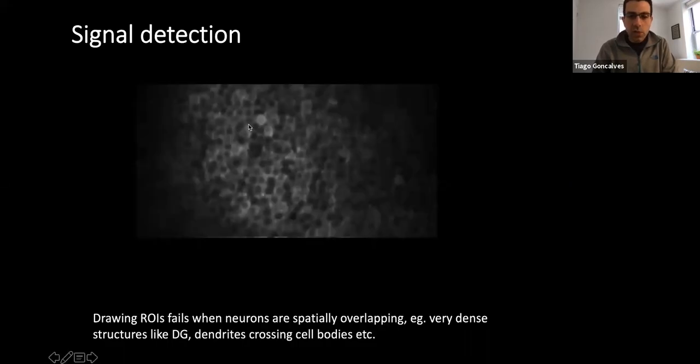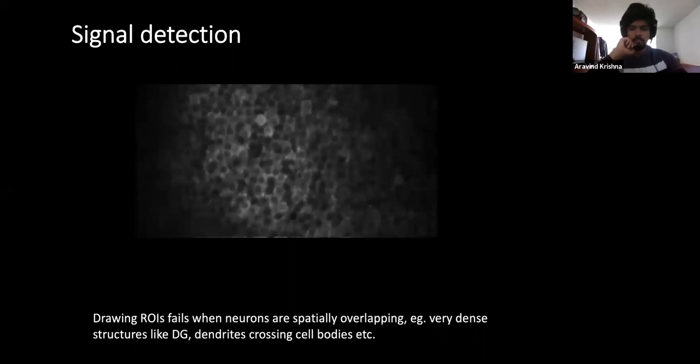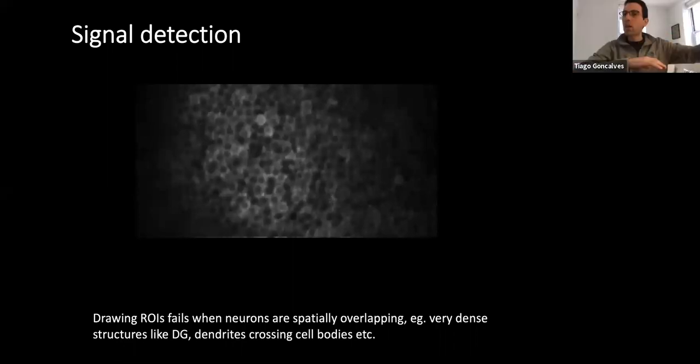You see, this is an average image, and it's usually very clean. Because it's averaged, you can tell the intricacies of your structure very well. So, for example, you see these cells here. These cells are labeled with jRGECO, and because it's an average image, you even see this shadow here. You see this? What do you think that is? Why do you have these dark shadows? They're like blood vessels. Yeah, exactly. So you see the blood vessels, they cast a shadow over your sample.